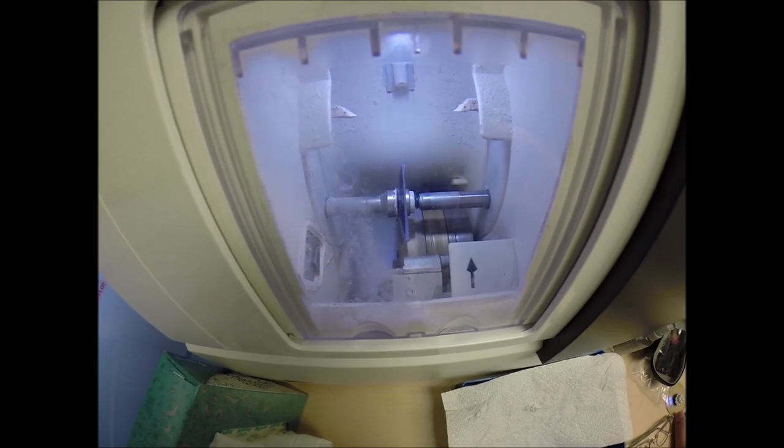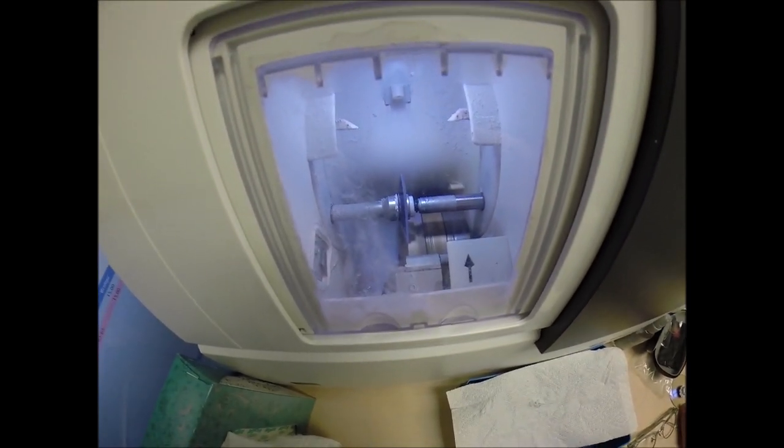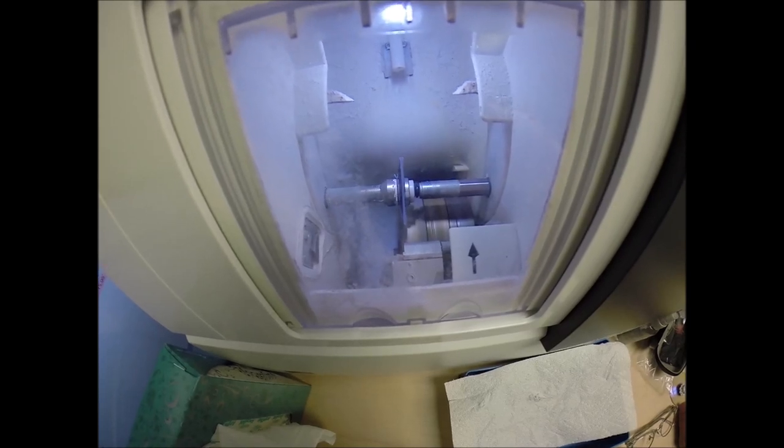Polycarbonate lenses are cut dry, meaning no water sprays onto the lens for the duration of the cutting cycle. Plastic, high-index plastic, and Trivex lenses cut wet, meaning water does spray onto the lens the entire time you hear the grinding. Water will spray onto your lens only for the last 20 seconds, just to wash away any optical debris — also known as shwarf — that may form on the edge.